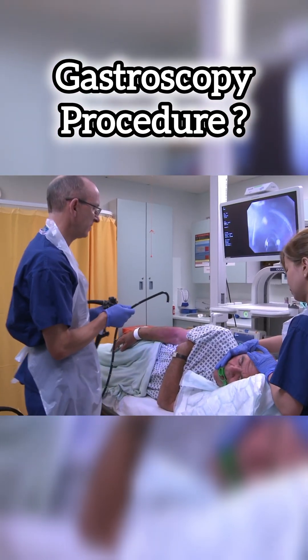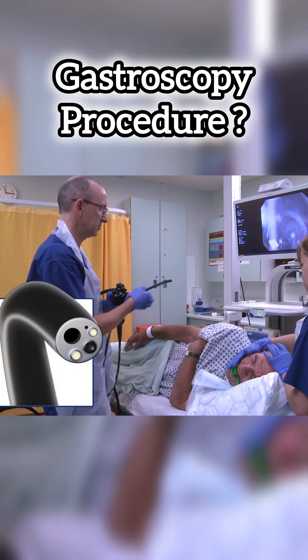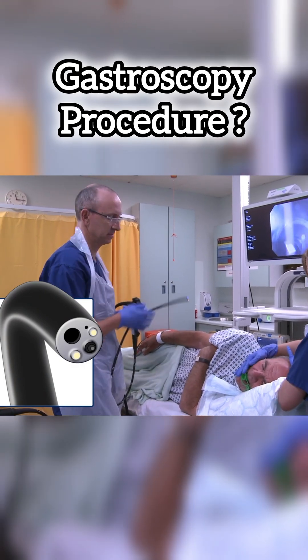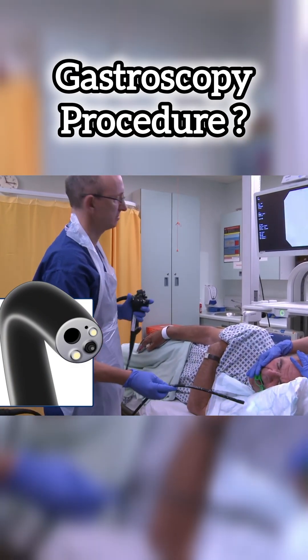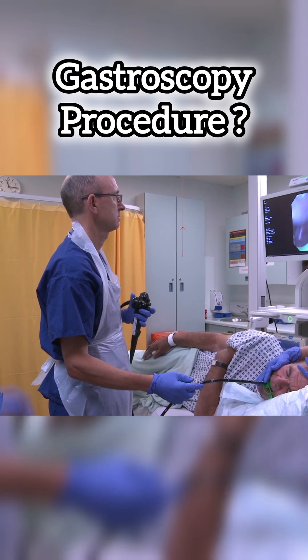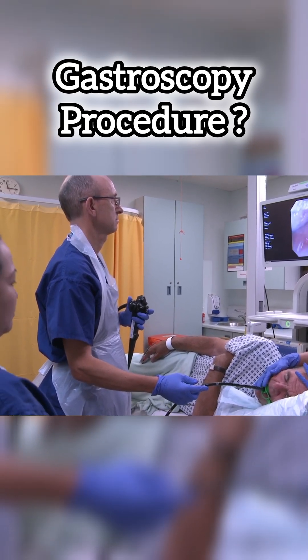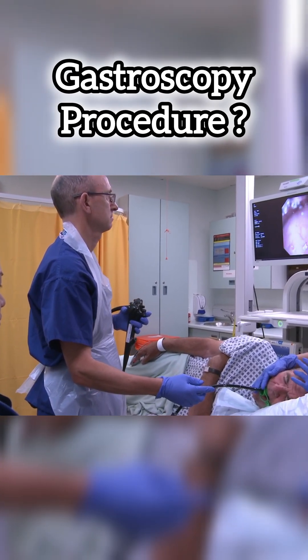The procedure involves passing an endoscope, which is a narrow flexible tube with a mini video camera built into its end, through the mouth, into the gullet and then into the stomach and duodenum to examine the lining.